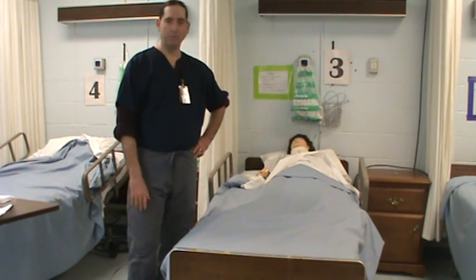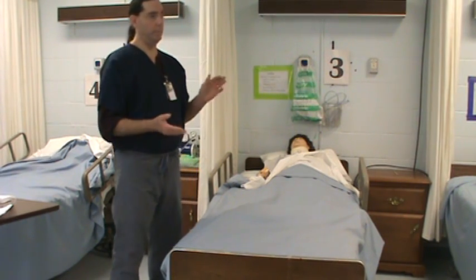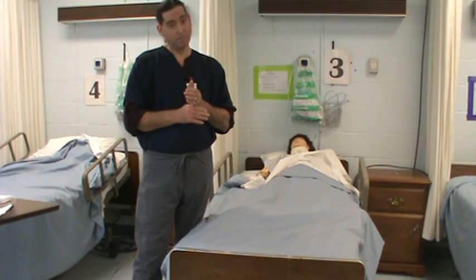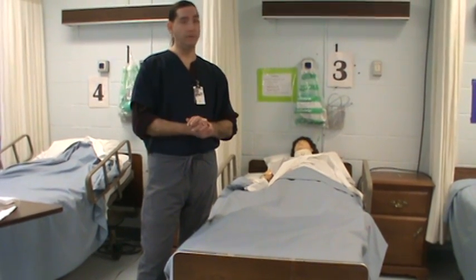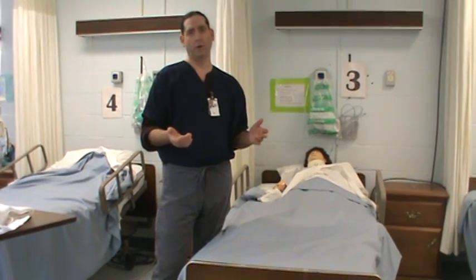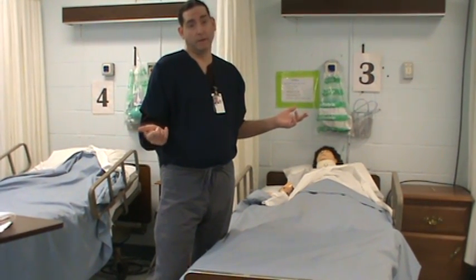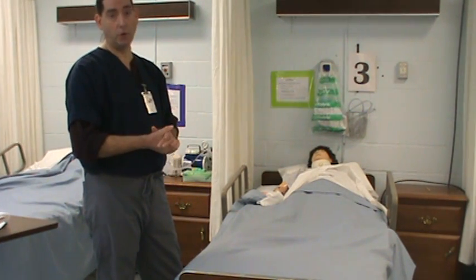Jim Adams here. I'm going to show you how to place a Foley catheter. On all your check-offs, you've got to remember the simplest things that can make you fail. Because I can say one thing during the check-off, and if you make it — you forgot to introduce yourself, you forgot to check the order — then when it gets down to something later on that you might miss, you didn't pass. So make sure you get those first simple things done.